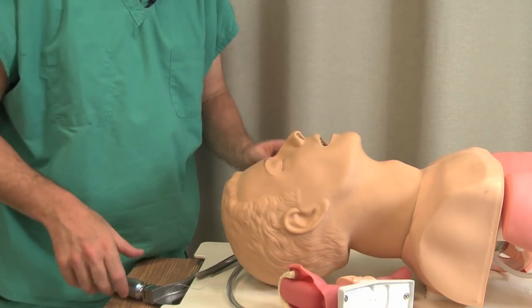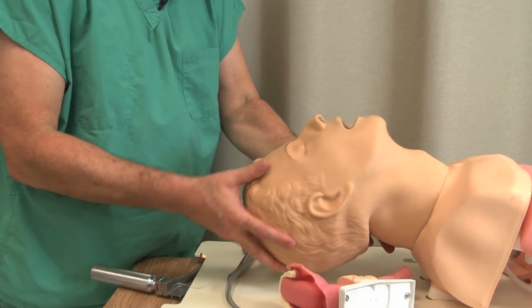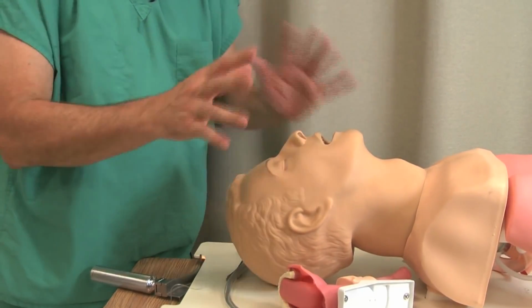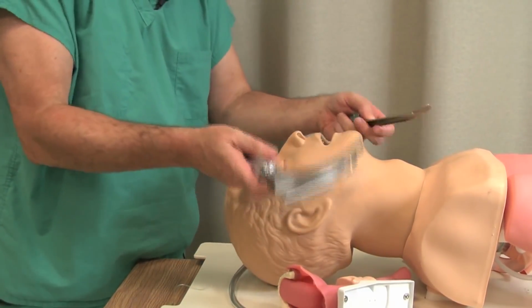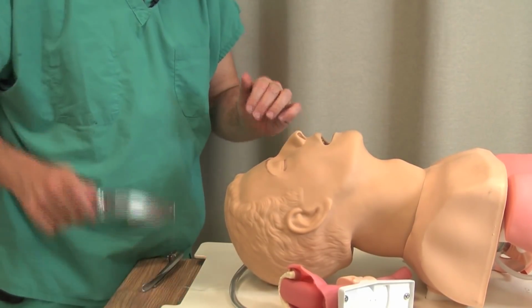So change something, and that includes change the blade, change the head position. Most often head position is what does it for you. You change the head position and life gets better. Do something different. Don't reinforce failure. If you've really exhausted your efforts at this, then go to something else. Go to an LMA or go to a fiber optic.